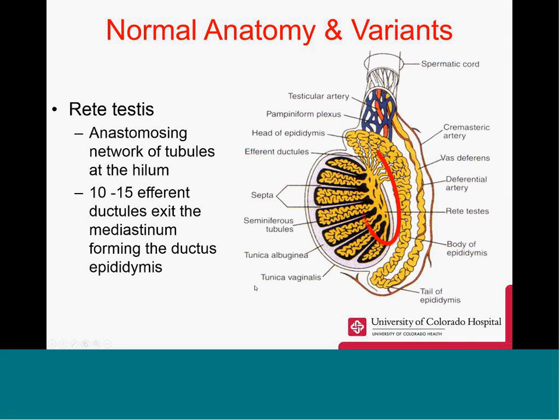Here we can see the rete testis. Seminiferous tubules located within the lobules converge to make our efferent ductules, which is about 10 to 15 ducts that exit the mediastinum to form the ductus epididymis.